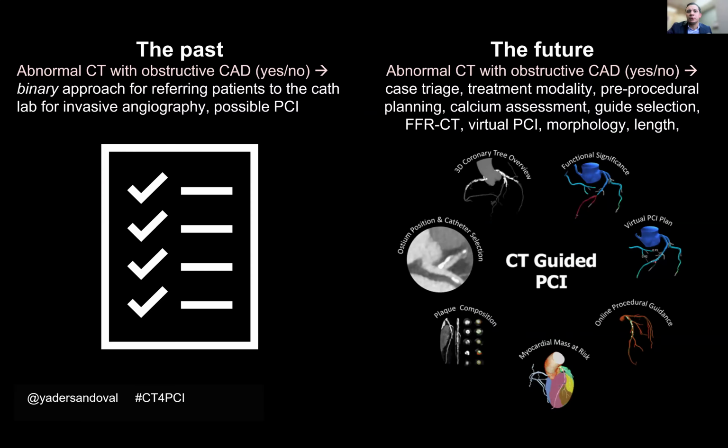And to wrap up, I will say that we're just shifting. We're shifting from the past, in which we would just rely on looking at a PDF, an EPIC report, to make our clinical decisions, to now really entering an area in which we want to interact with this data to unlock this concept of CT-guided PCI to improve procedural planning. And with that, I'll wrap it up. Thank you so much.